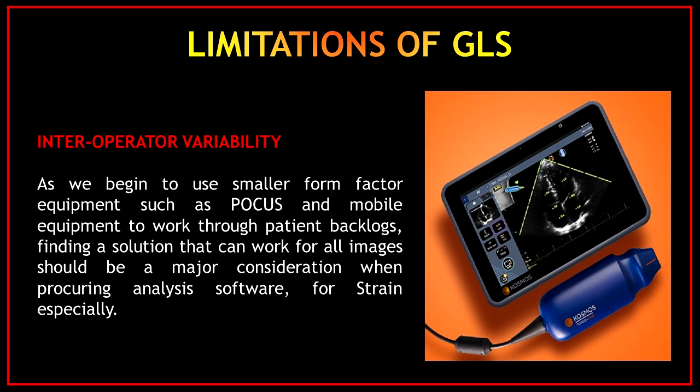As we begin to use smaller form factor equipment such as POCUS and mobile equipment to work through patient backlogs, finding a solution that can work for all images should be a major consideration when procuring analysis software, for strain especially.